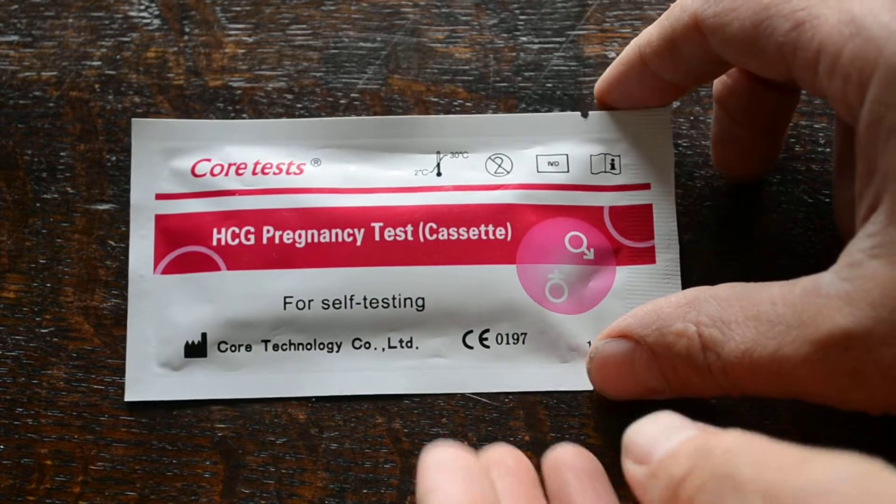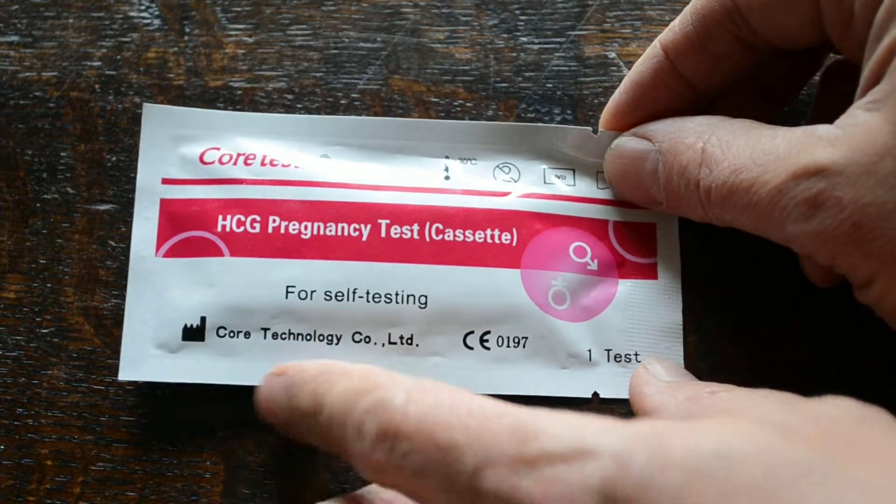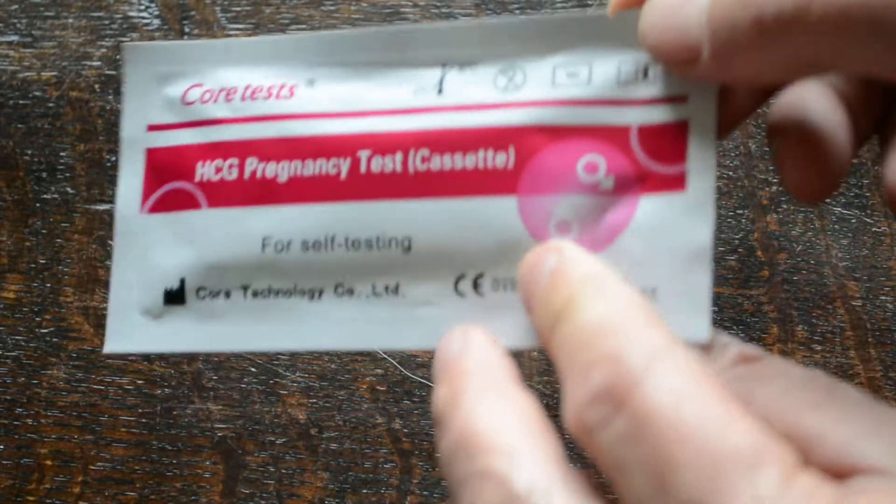Here's the foil. You can see a very bright pink foil, good quality aluminium foil. It's got the manufacturer's details on here. The CE mark is 0197 and it contains one test.